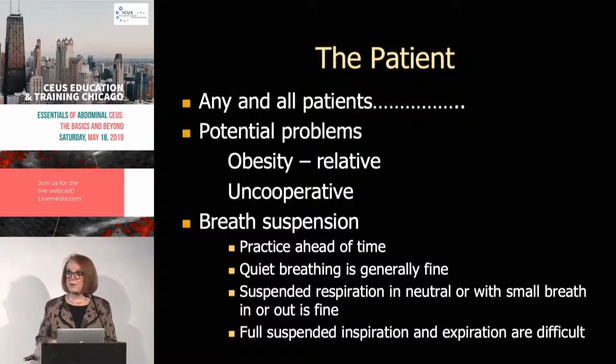So you'd have to practice with the patient again and just say to them, no, I'm just going to tell you to stop right now. And then they'll practice with you. They'll understand. Otherwise, if you say stop breathing, they'll take a breath in and then they'll stop. And so you have to make sure they understand.